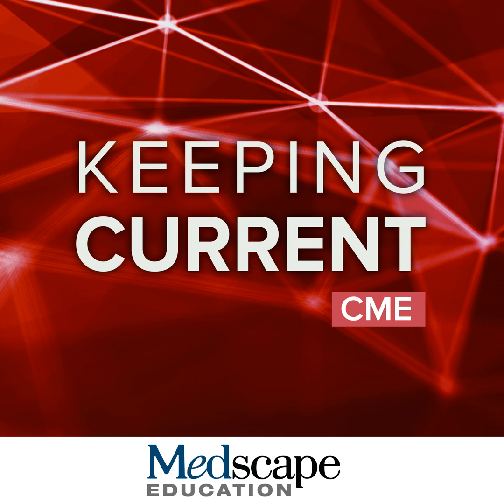A lot of focus in recent years has been on developing a more rapid, simple CMR protocol. And this is shown here, where we use a much more accelerated technique for imaging the heart. So in this case, it's called real-time compressed sensing cine MRI, where you cover the heart, free breathing, from top to bottom very rapidly, give the contrast early. You do a very rapid delayed enhanced imaging protocol. In this case, it's a motion corrected single shot technique where the patient can be free breathing, and it covers the entire heart in multiple orientations.